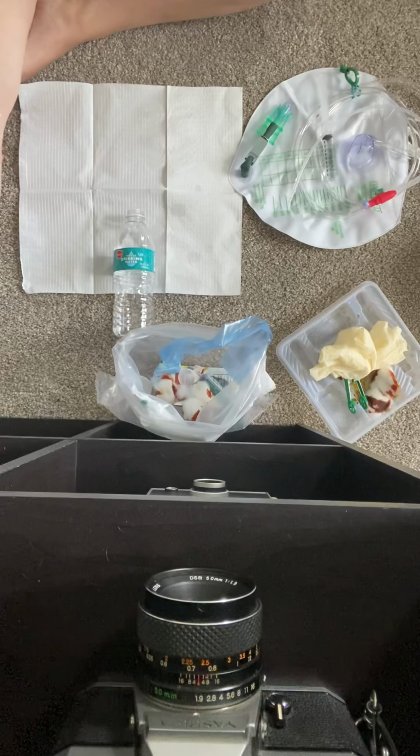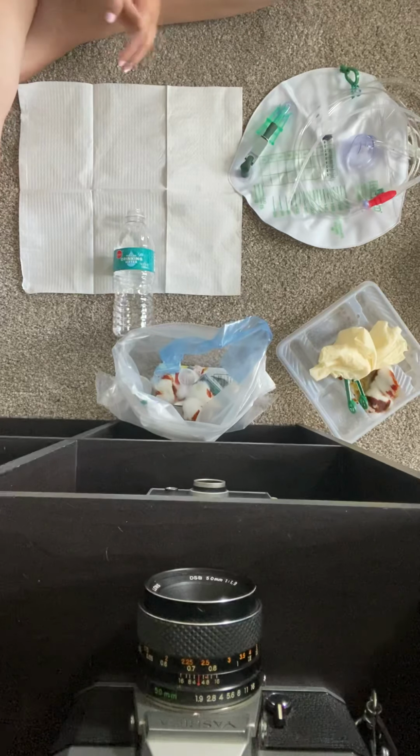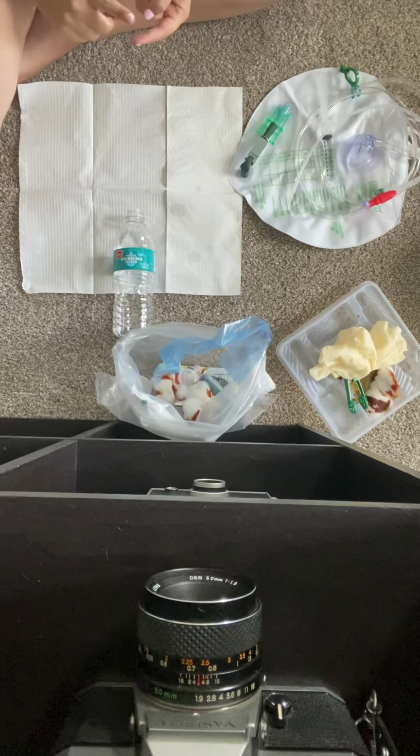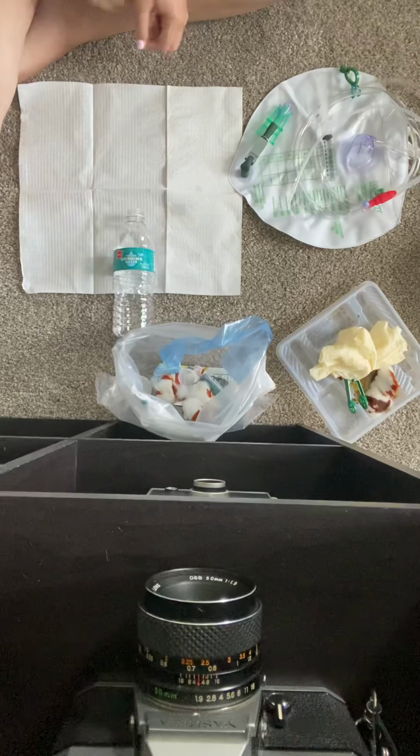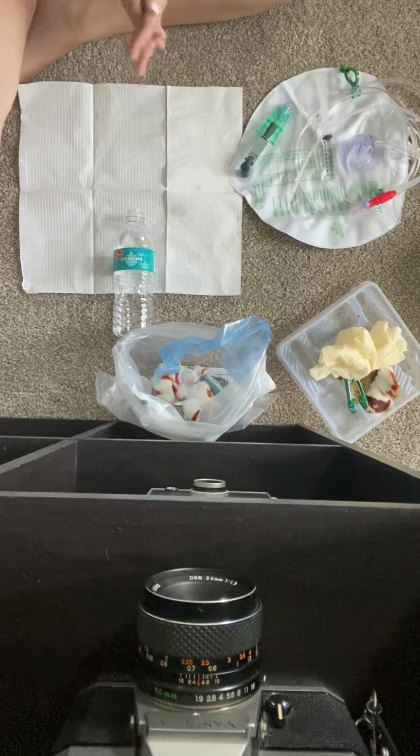And before leaving my patient's room, I wanna make sure that their bed is in the lowest position, and obviously I would clean all this up too. Bed is in the lowest position, bed is locked, chair alarm, bed alarm is on, call light is within reach, and then I would do my hand hygiene again as I come out.